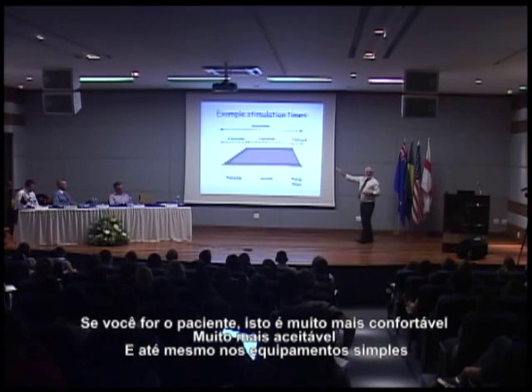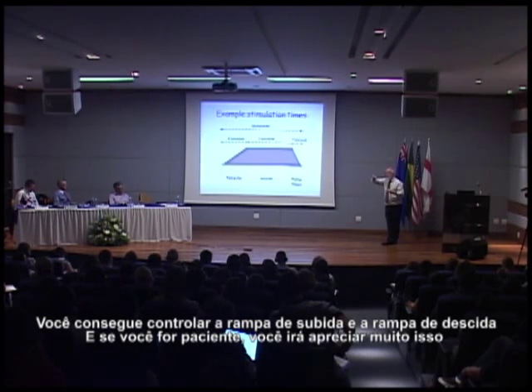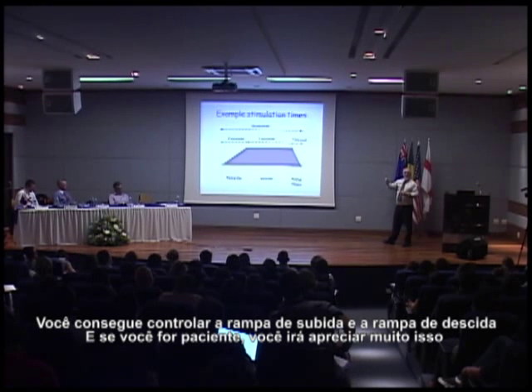If you're a patient, that's much more comfortable, much more acceptable. And even on the simple machines, you can control ramp up and ramp down. And if you're a patient, you will appreciate that a lot.